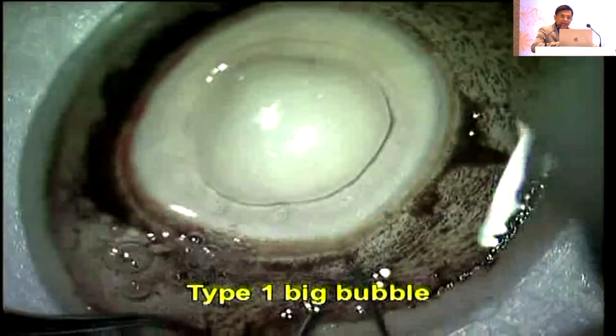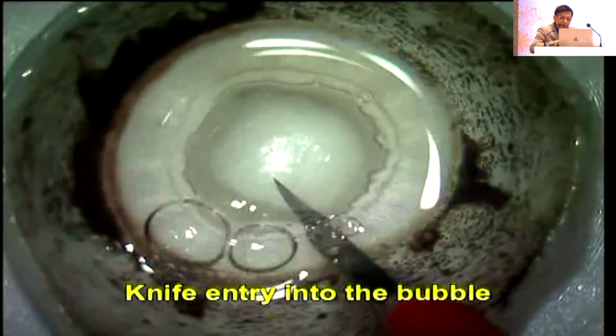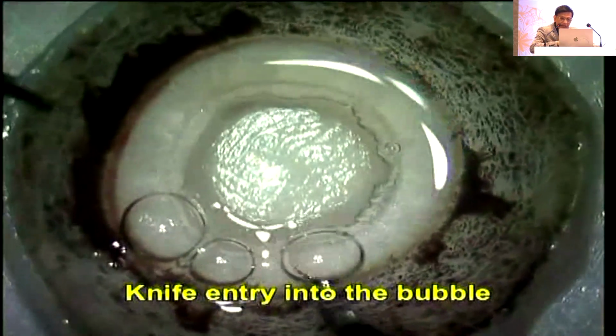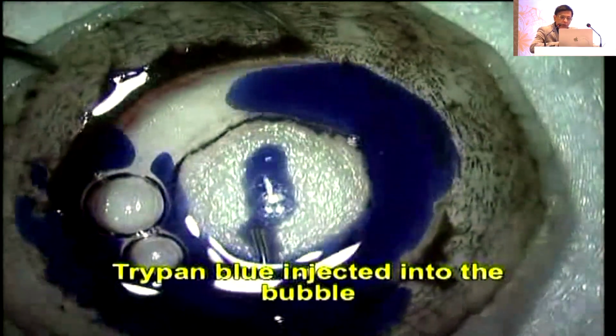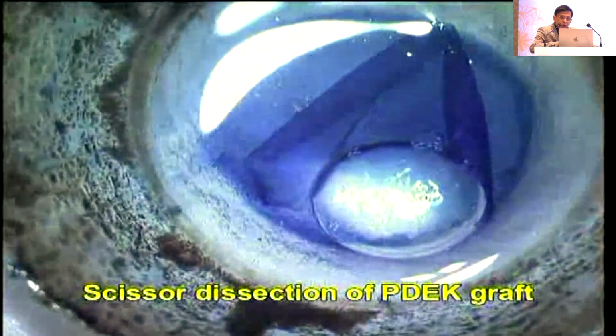So where is the air? You have the endothelium, you have got the Descemet's, you've got the Dua's layer, and then the bubble, and then the remaining structure, which is stroma. If it went to the periphery, it's a type 2 bubble. That means basically you have endothelium, Descemet's, then the bubble, and then the Dua's and the stroma. So we are not interested in creating the DMEK bubble, we are trying to create the PDEK bubble. Enter into this, inject trypan blue now, so that stains everything, dissect it, and now you have the PDEK graft ready.